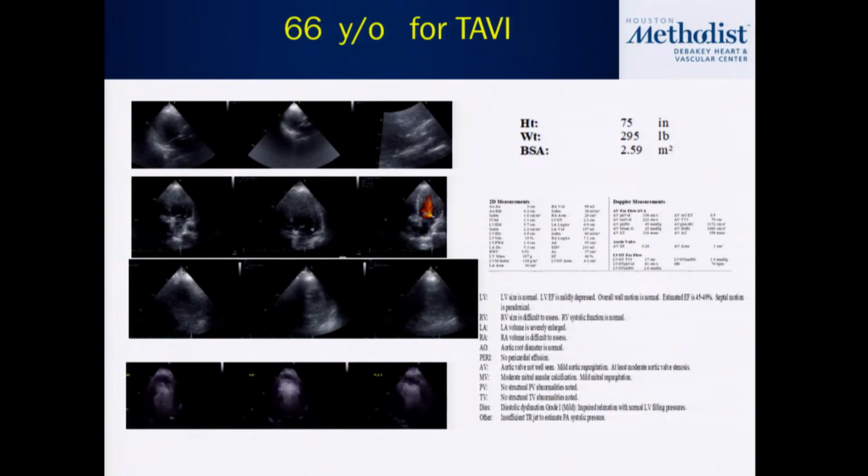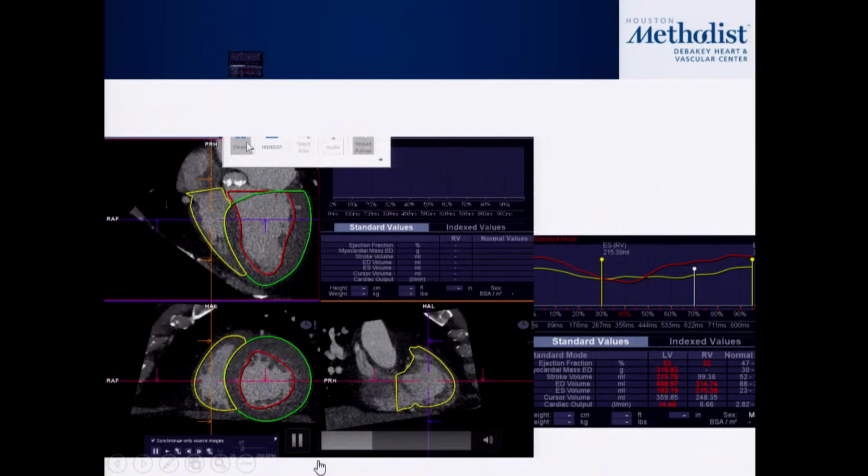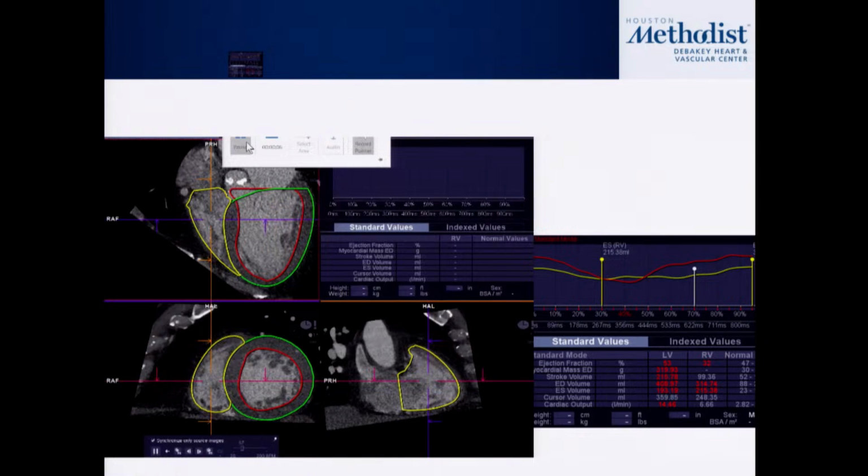So just look at these images compared to, okay, unfortunately. Oh yeah, there we go. I mean, I don't need to convince you which one is more reproducible, and so we almost never do EF assessment with CT, but when you have the information, you gotta utilize it and report it, okay? Especially for the RV, which is a very difficult chamber, with the images CT offers, if you properly contrast, you can really calculate the EF very accurately.